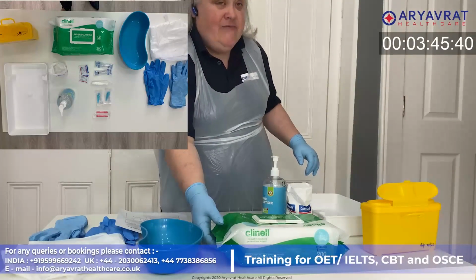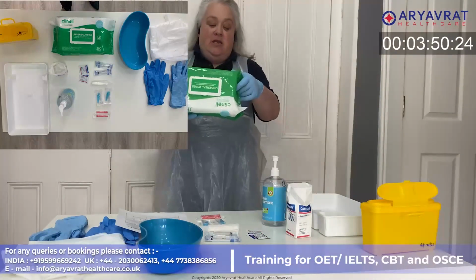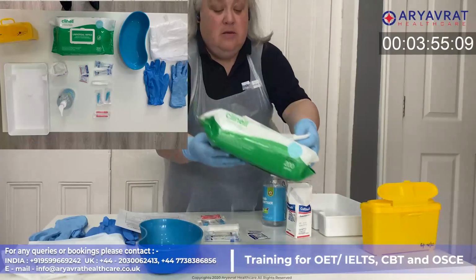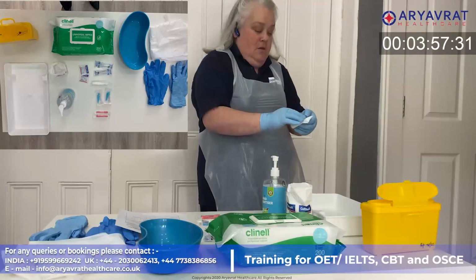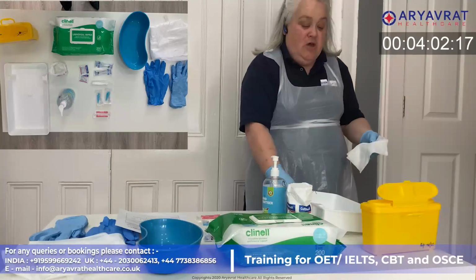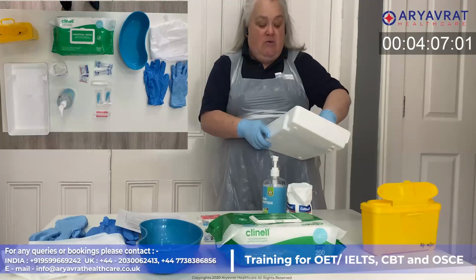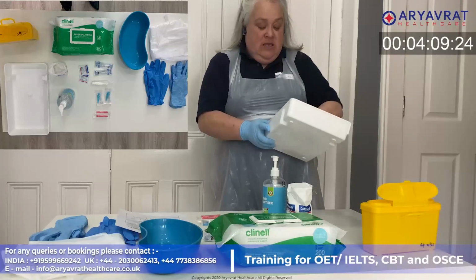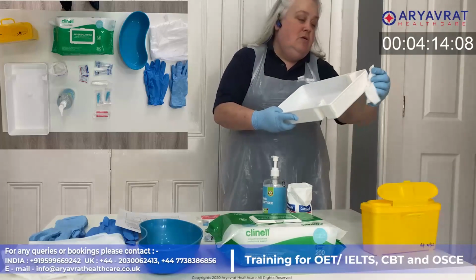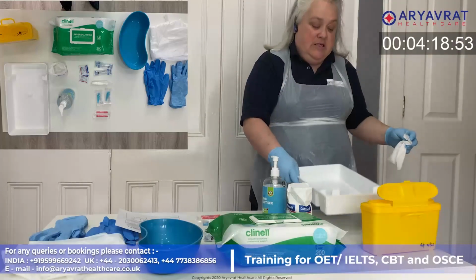So I'm going to use 70% alcohol wipe, checking the expiry date, and I'm going to clean the tray, which has already been washed with soap and water in the last 24 hours, so I'm just wiping with the alcohol wipe at this time, making sure that it's clean.